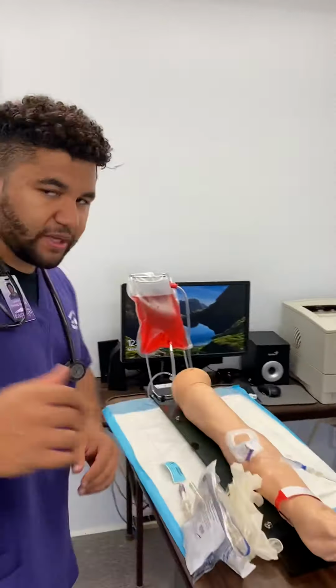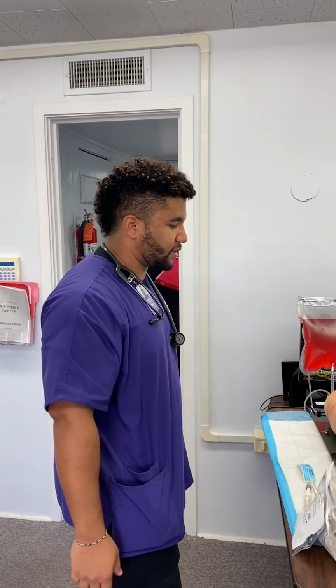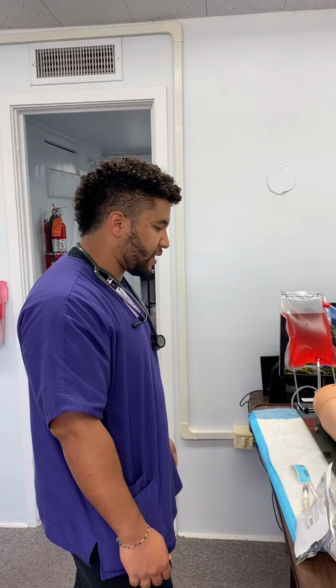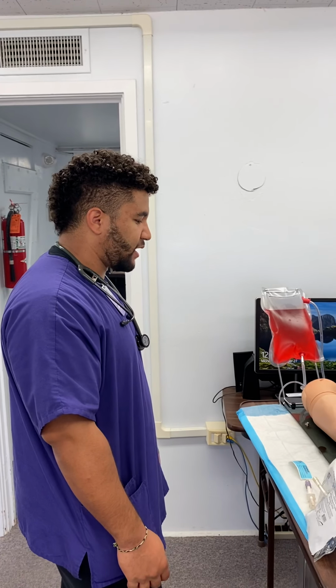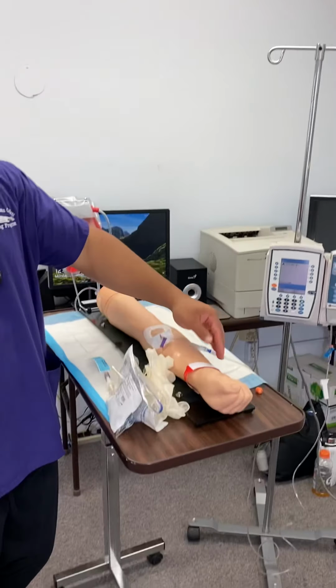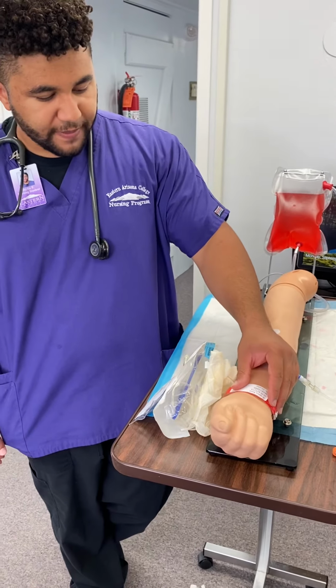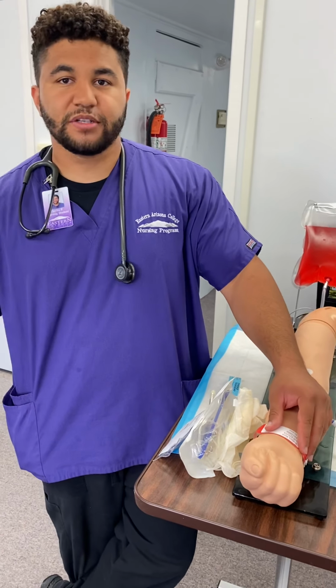On the way in, go ahead and do hand hygiene and introduce yourself to the patient. Hello, my name is Jay. I'm going to be your nurse today. The doctor has ordered some antibiotics for you, so we will go ahead and hang that. But before we start, can I get your name and date of birth? And we have Waters Kent, 4774, and we would confirm that we have the right patient.